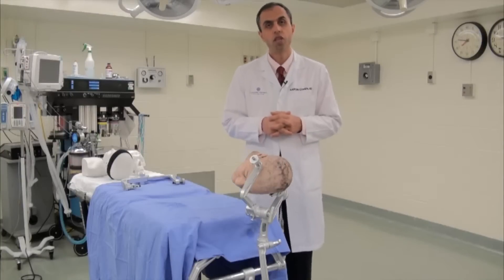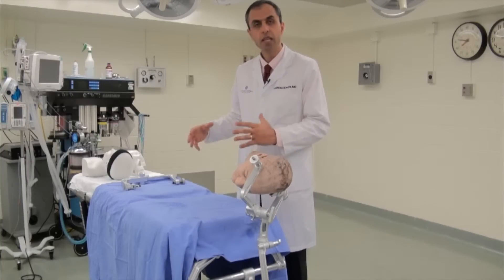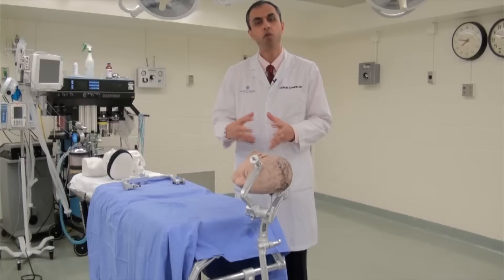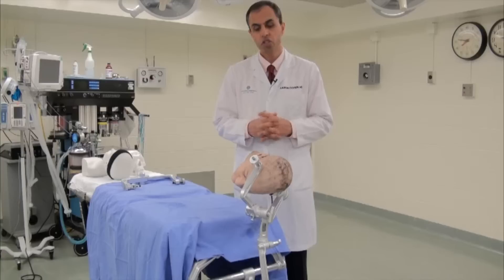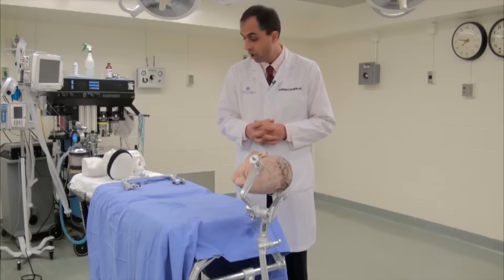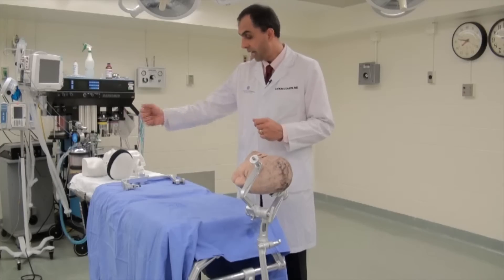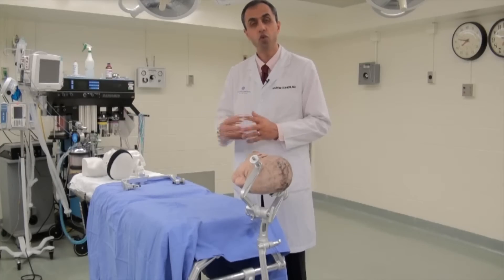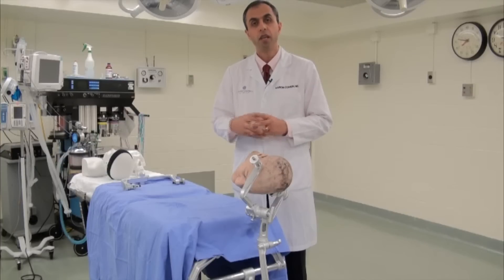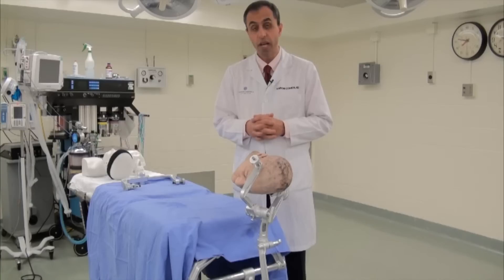For the suboccipital approach, the patient is placed most commonly in a lateral position. The lateral position places the neck in a more physiological position parallel to the long axis of the spine. All the pressure points for the torso are well padded, and ample amount of tape is used across the pelvis to make sure the patient cannot be repositioned during the procedure and after draping.